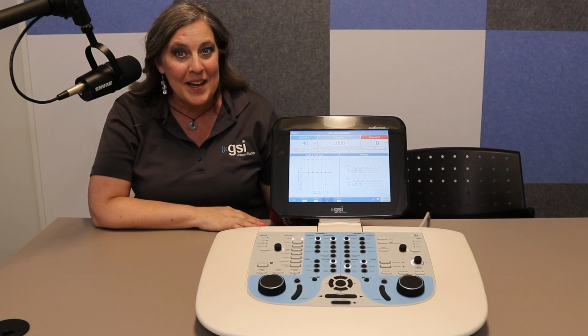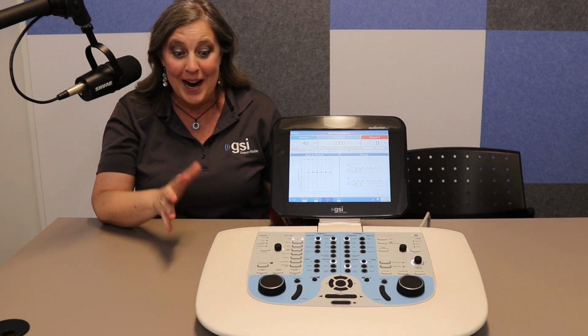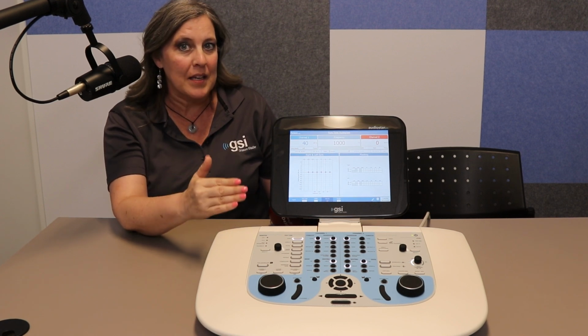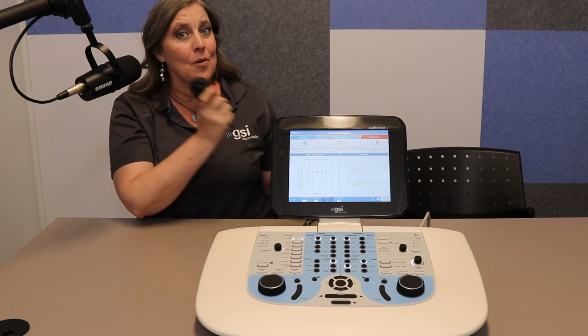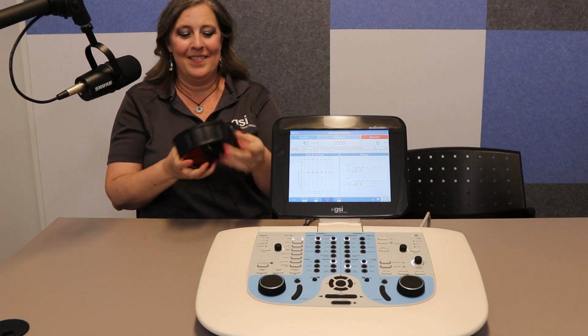All right, now that we're ready to do the ACT, let's make sure that we have all of the important and necessary items. First, you need your AudioStar with an ACT license. And on the AudioStar, you need to have the patient thresholds in both ears from 250 hertz to 8,000 hertz. Then we're going to use the headphones and also the patient response button. So let's get started.